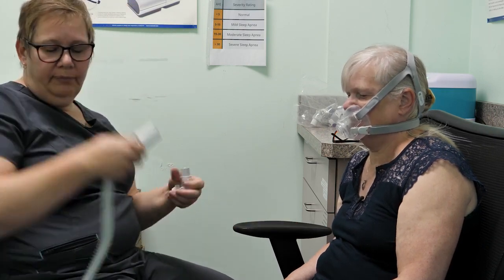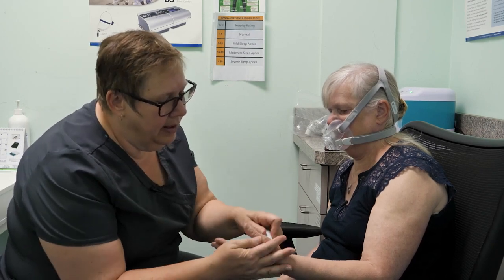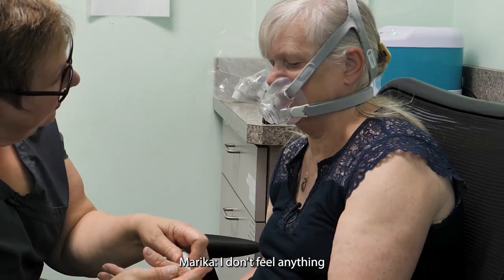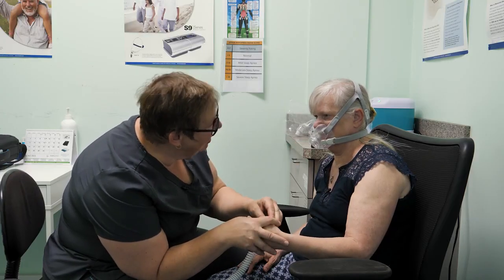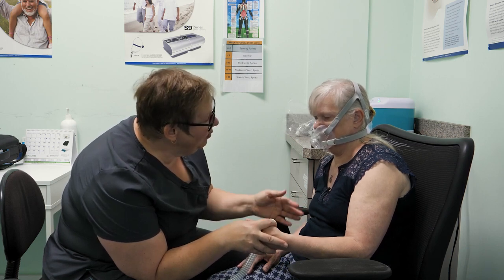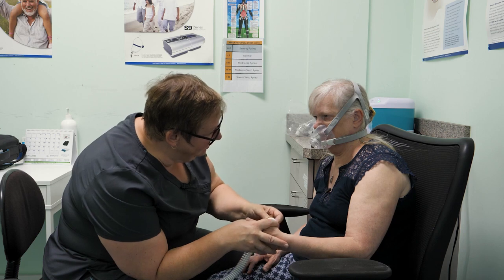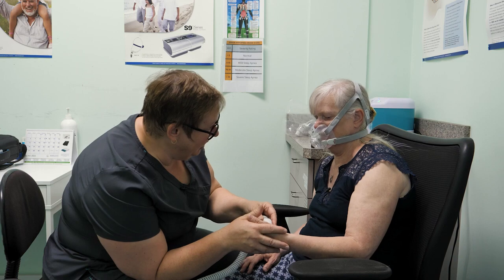Okay. Now, I want you to press the on button again for me. All right. And I want you to put your hand like this for me. So you can see we're at a pressure of 5. How does that feel? I don't feel anything. Okay, so once we get the mask on, fitted really well, it should feel comfortable. It should be okay, kind of like this. But when we're adjusting the mask and trying to find the fit, you may feel this. So I just don't want you to be alarmed, all right?